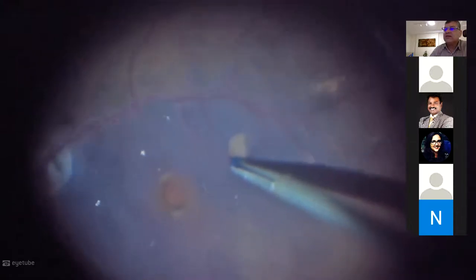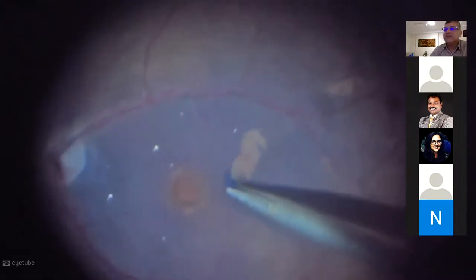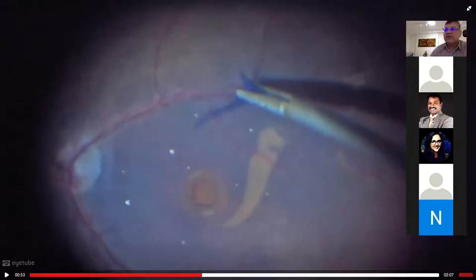It's easy to start a vertical peel. You created that small tear — you can see the vessel here. You've got to be very careful not to go deep and cause any bleeding. When I got this small pinch and went downwards, I opened this comma-like tear. Should I keep going and grabbing here and go around? No, you don't need that — since you've opened the door, you just get a leaflet and follow the other way around.